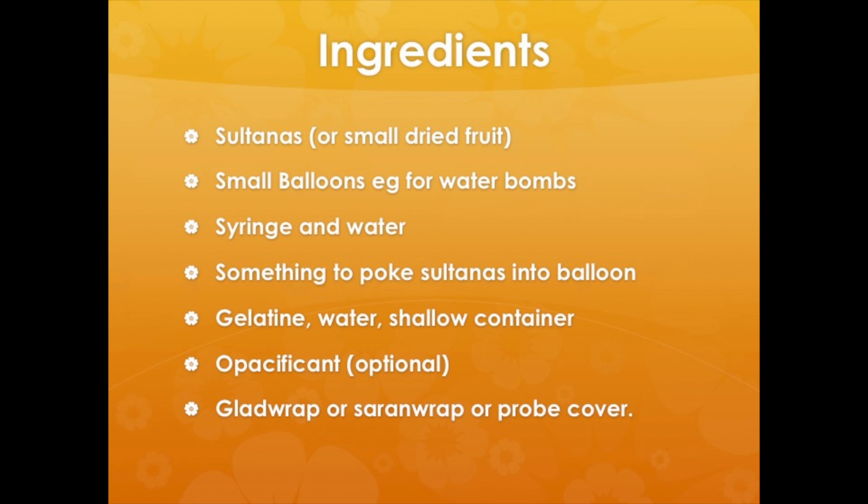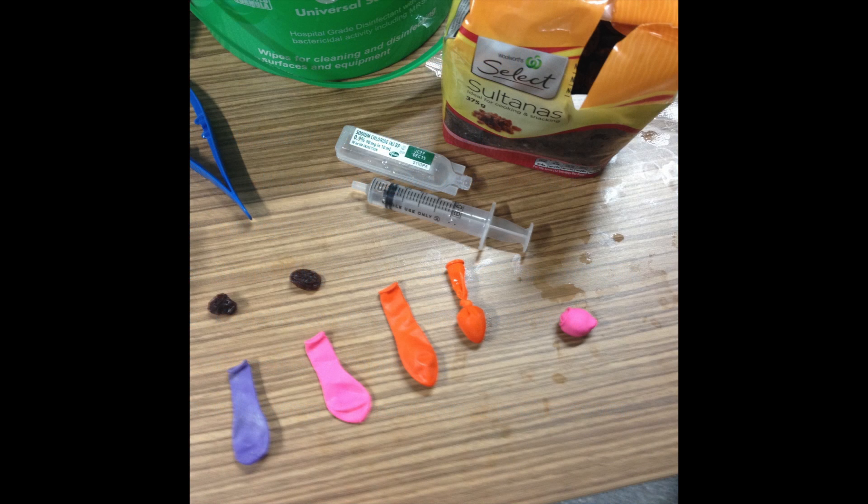The ingredients are simple — anyone who makes ultrasound models in the kitchen will have these things available. You take the sultana, poke it into the little balloon, put a little bit of saline around it to remove the air, then tie a knot at the base and fold the tail back over the balloon.